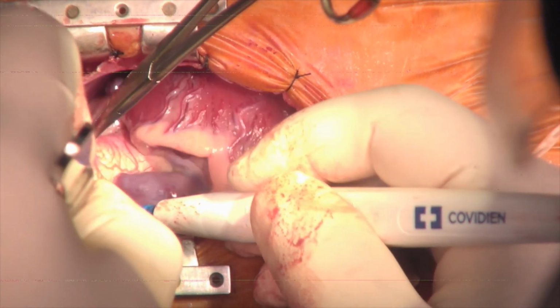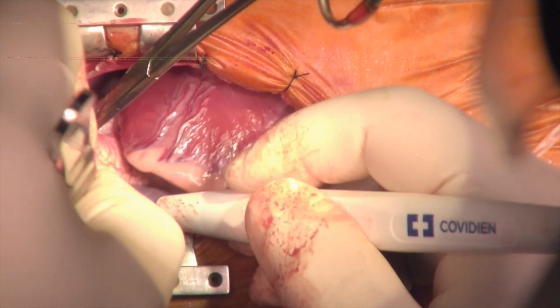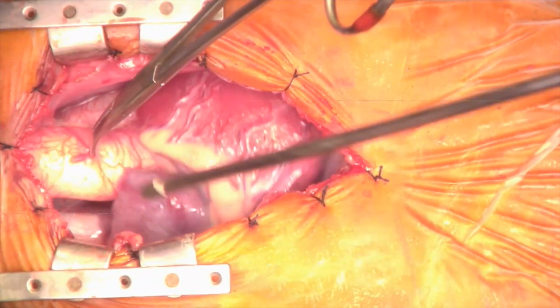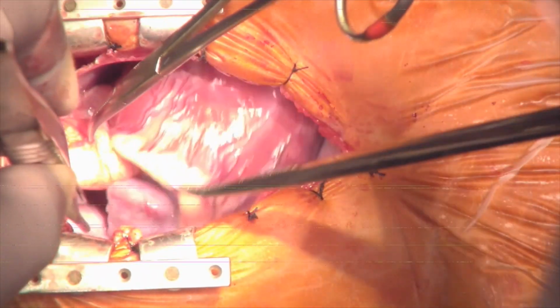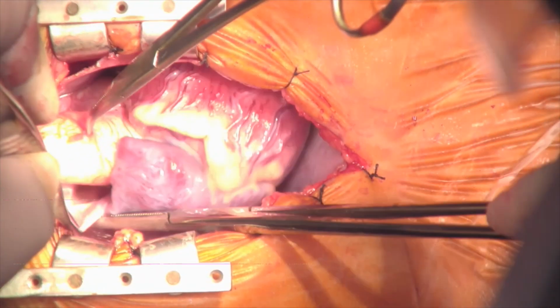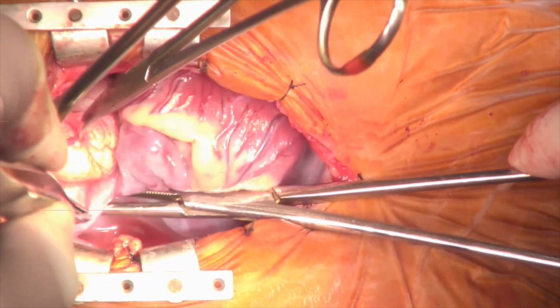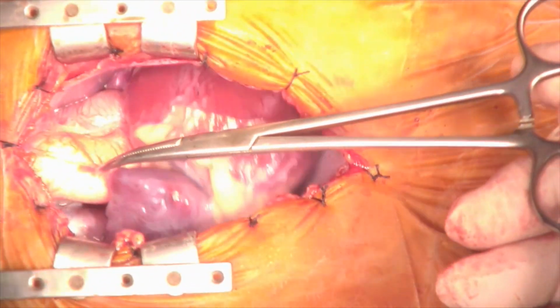Where the right pulmonary artery runs behind the superior vena cava, the pericardium is incised. The tip of a right-angled forceps is passed behind the superior vena cava through the incision in the pericardium and used to plumb a path for the superior caval snare.